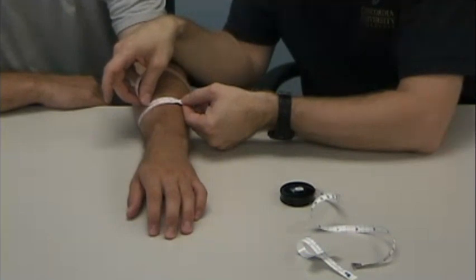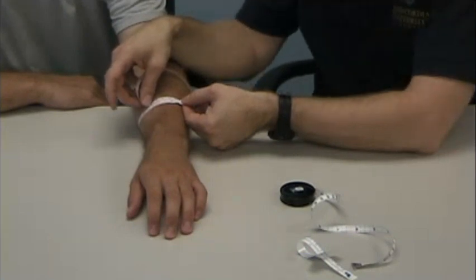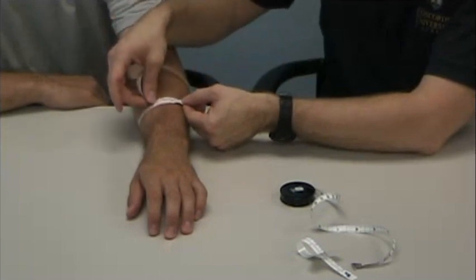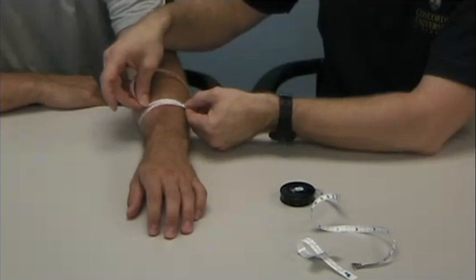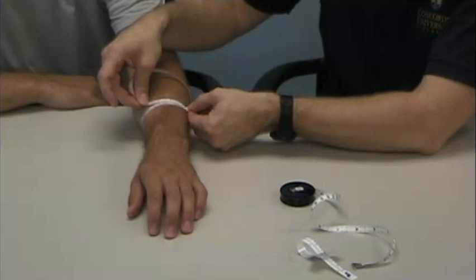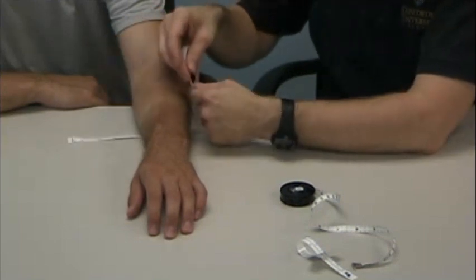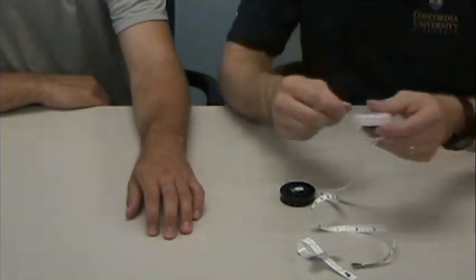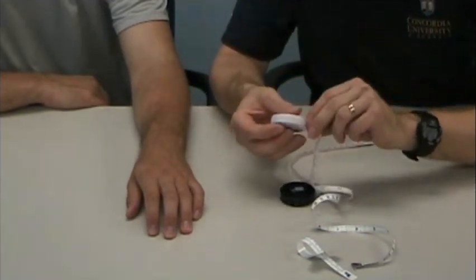But not tight, I come up with 23.7 centimeters at the middle of his forearm. If I pull it snug, I can get that down to about 22.5 centimeters. If I really pull it snug, I can get it down to about 21.5 centimeters. So depending on how tight you pull the tape, that greatly affects the measurement.